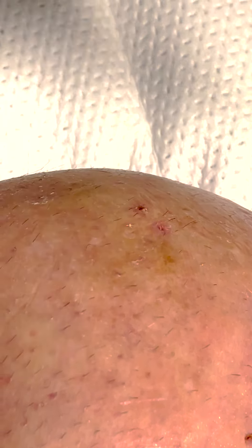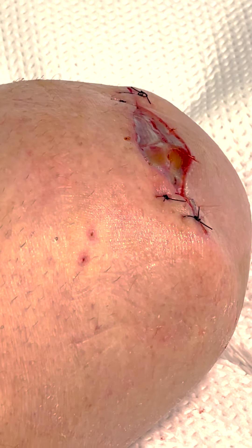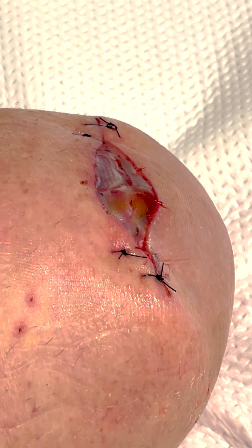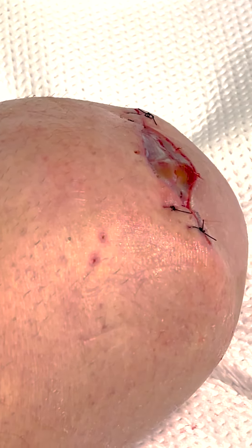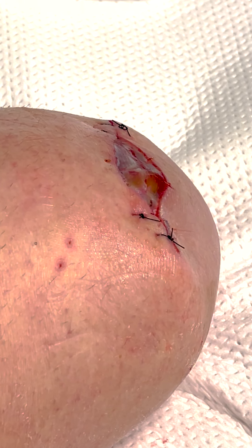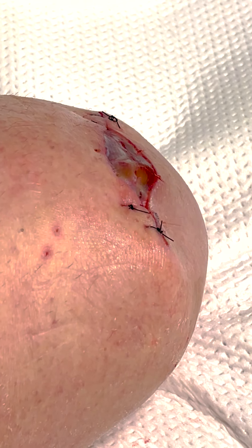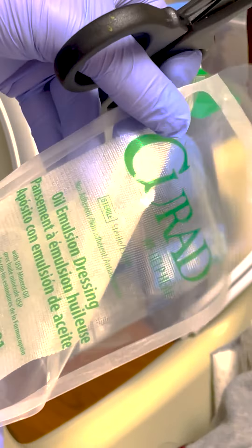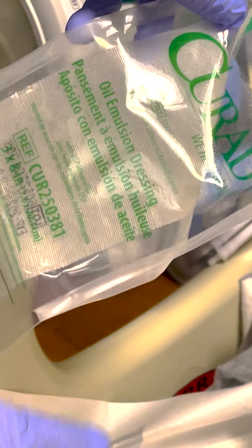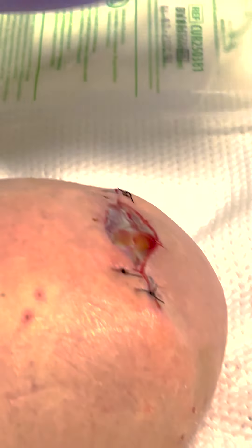As you can see, it just bends the staple out so it comes out. The wound looks good — there's no indication of any infection, there's no inflammation, which is awesome. I do have my stump shrinkers this time so we'll be able to control the edema that wasn't controlled last time. Now the nurse is putting on the Adaptic, which is an oil emulsion dressing that helps keep it nice and moist so it doesn't get dry and irritate you.